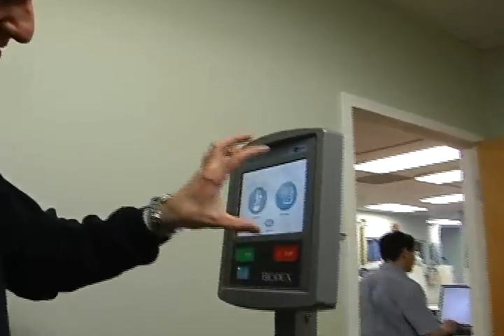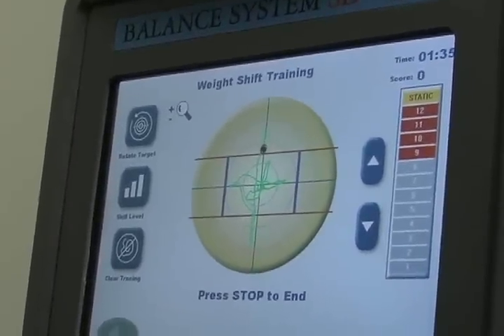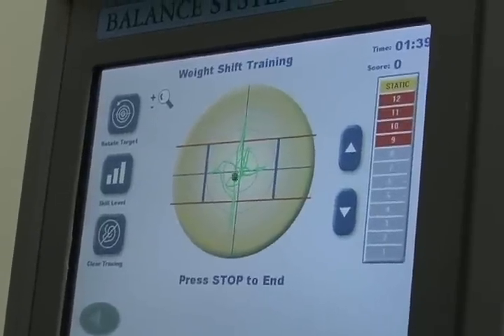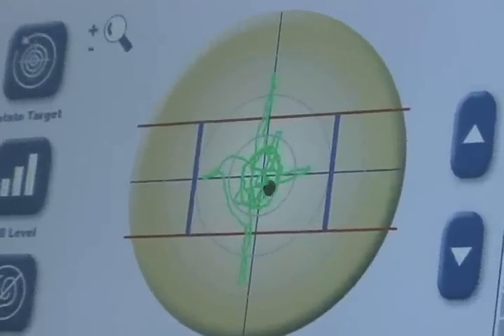You can see visually on the screen where you potentially stand — literally stand on your feet — and where you're weight-bearing. We can then do certain exercises that you can visually look at that would allow you to then have a better sense of your balance.